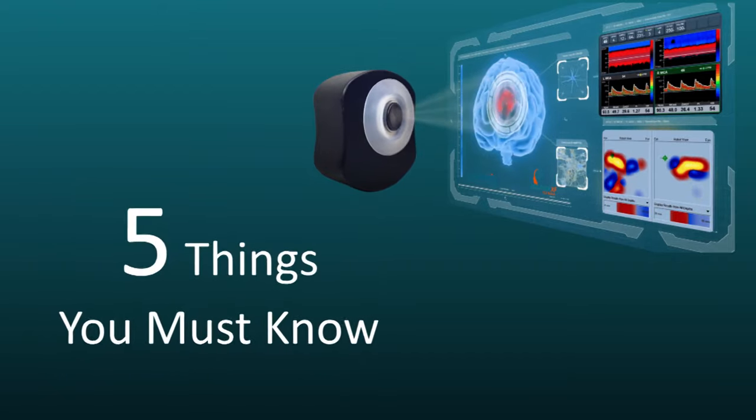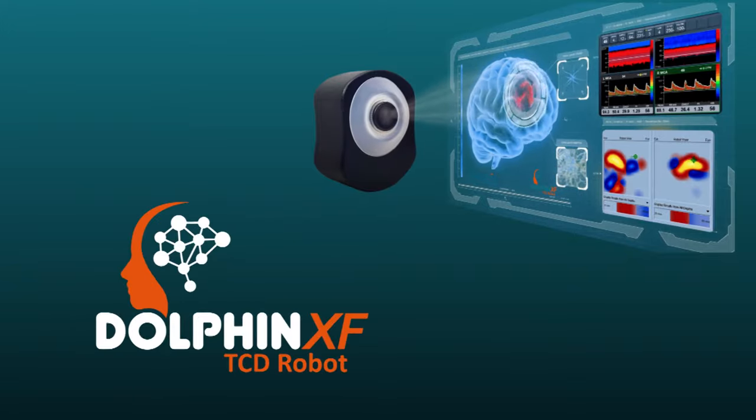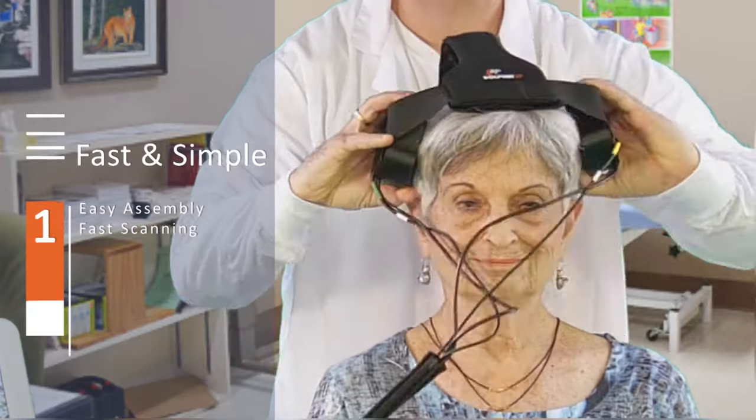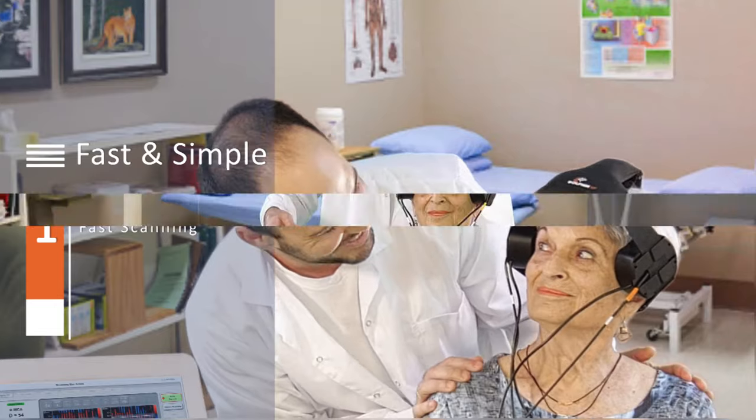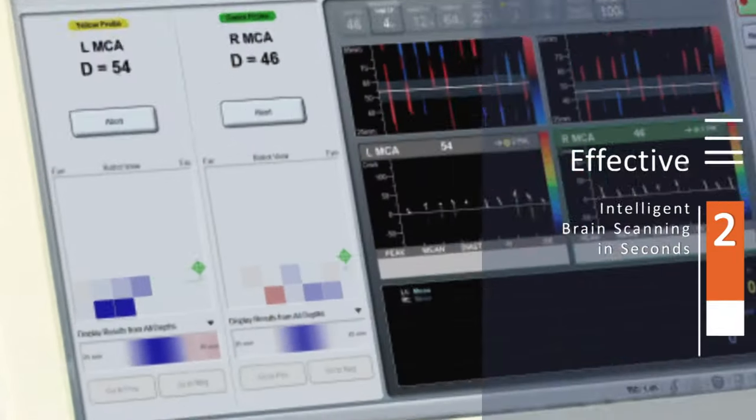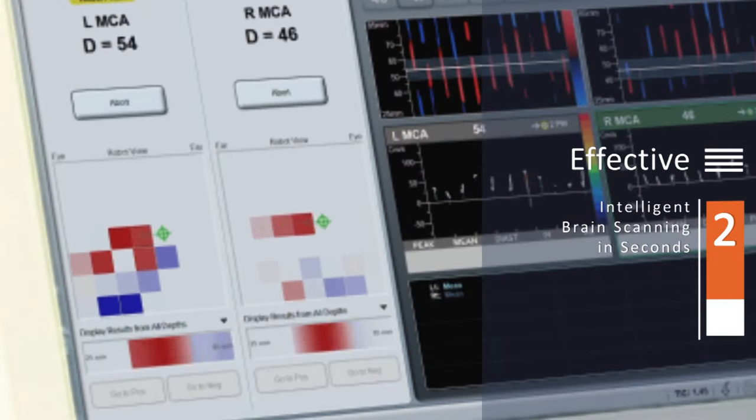Five things you must know about the exciting Dolphin XF TCD robot. It's easy to assemble and very simple to operate, with extremely fast and effective bilateral scanning in just a few seconds.